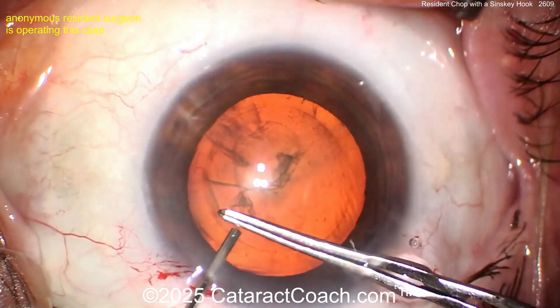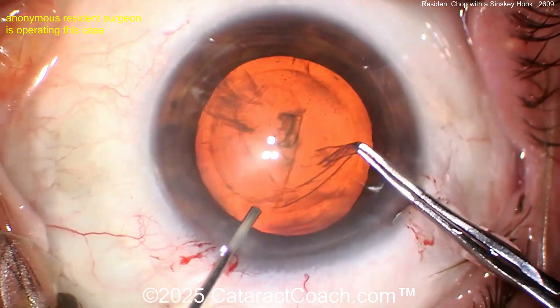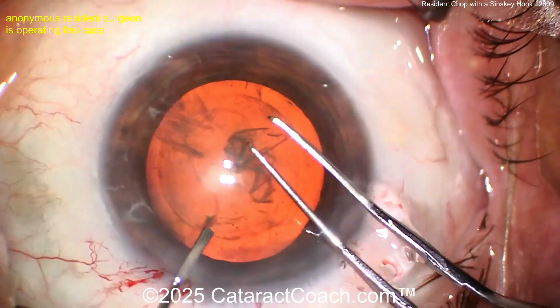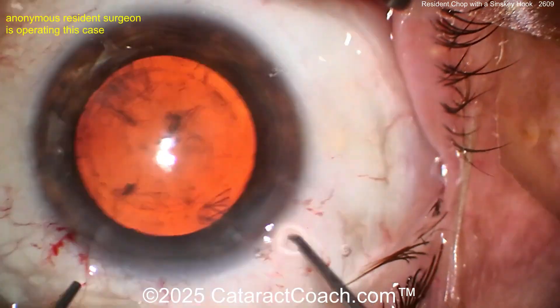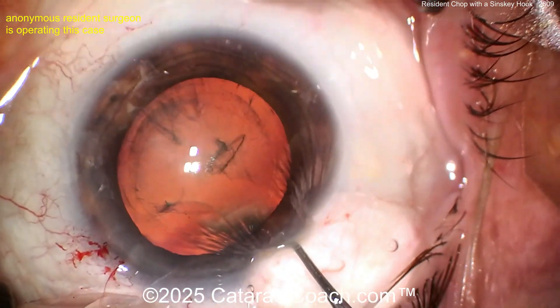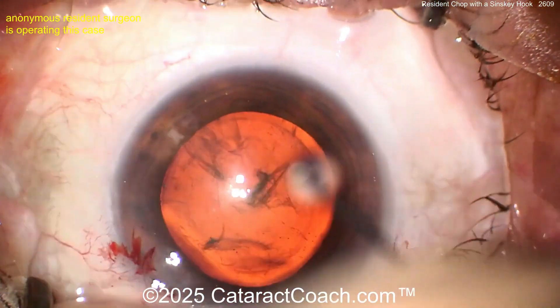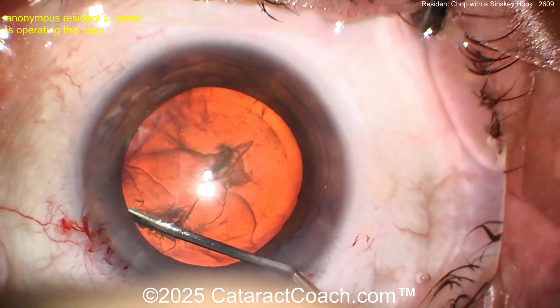Here comes the rhexis. Obviously a very experienced resident surgeon here, because you're getting a beautiful rhexis — exactly the way you outlined it, about five to five-and-a-half millimeters. Now getting some viscoelastic out of the eye, but see how the incision is a little short — I don't like that cone incision. I'm being honest.